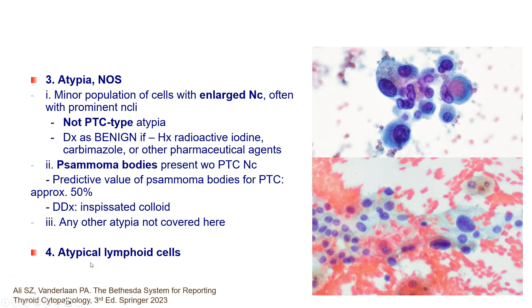Finally, if there are atypical lymphoid cells — perhaps a population that far exceeds the follicular cells, or a degree of monotony in the lymphocytes — then this would be classified as atypical lymphoid cells.